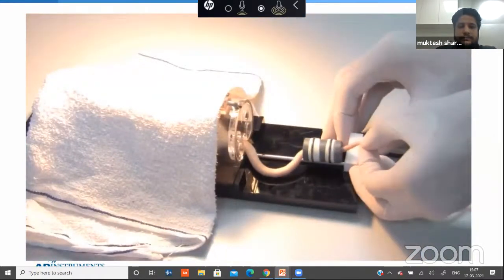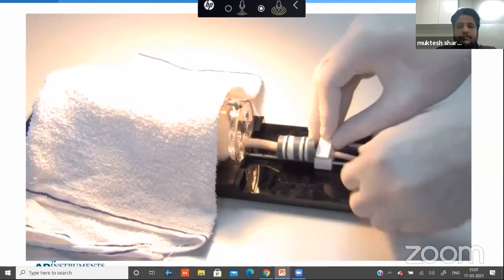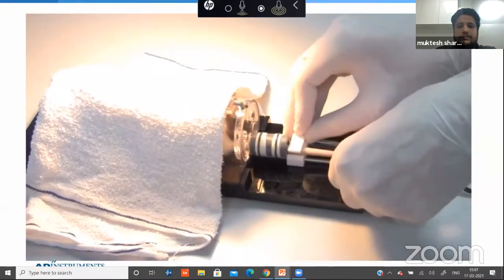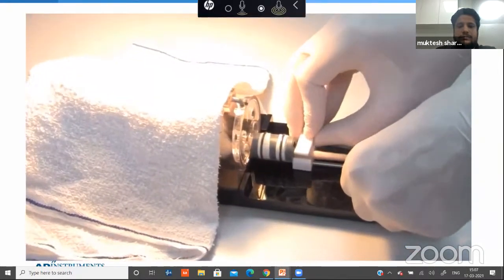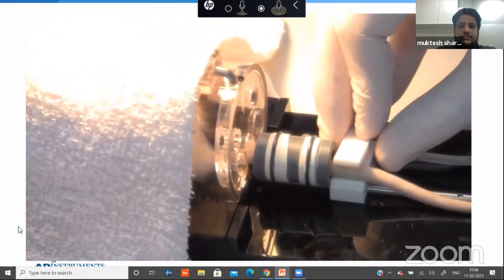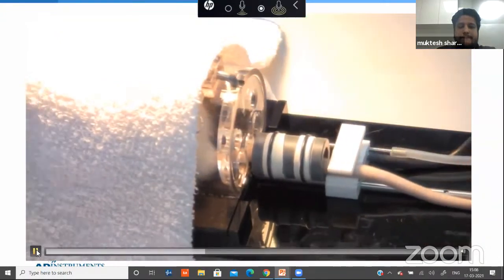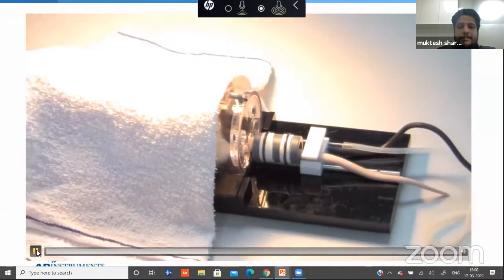The tail cuff is slid over the subject's tail along the tail cuff holder until it rests closely to the tail end of the restrainer. The tail is also placed securely within the pulse transducer. Once secured, ensure that the pulse transducer is not in contact with the tail cuff, as vibrations from the cuff may affect the pulse signal.